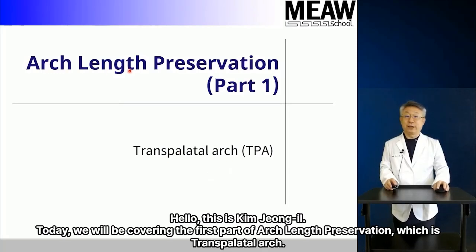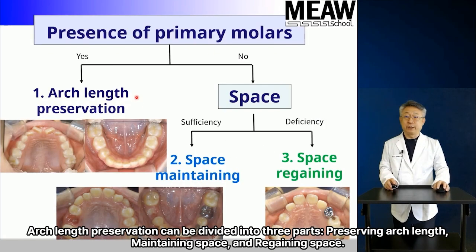Today, we will be covering the first part of arch length preservation, which is transpalatal arch. Arch length preservation can be divided into three parts: preserving arch length, maintaining space, and regaining space.